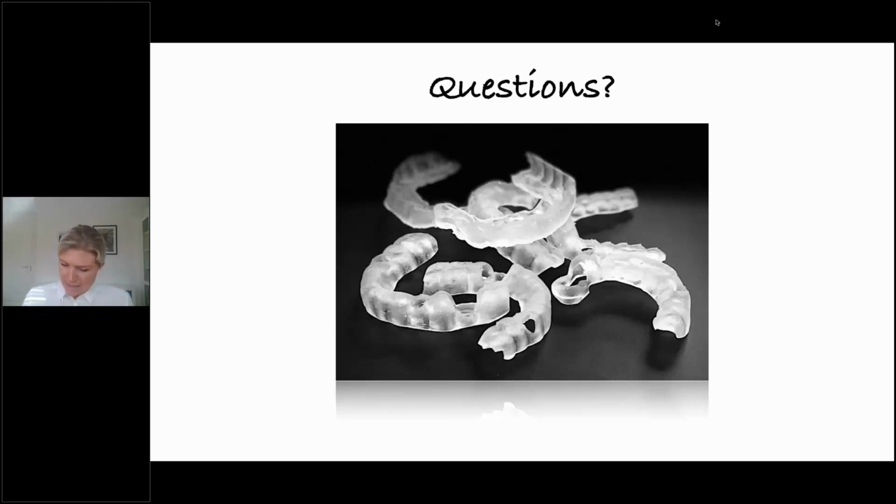Okay, thank you, Zach. And another question that we had was, which step do you think is the most complicated one in the digital implant workflow? For me, speaking as a periodontist, it's doing the wax ups. It's the restorative design. Now, those of you who are practicing CAD/CAM dentistry, it's going to be the opposite, right? There are steps that are critical. And I've also seen, as an instructor, how every step of the way can be messed up. But for me, it's the restorative wax up.